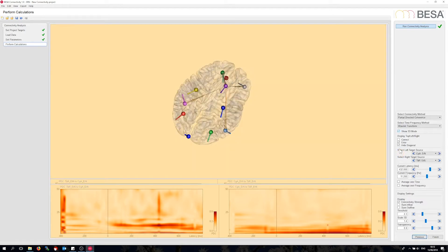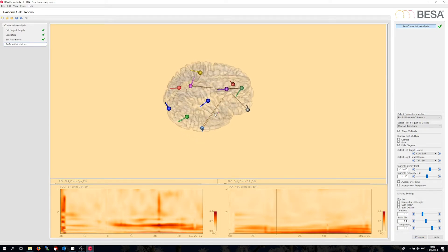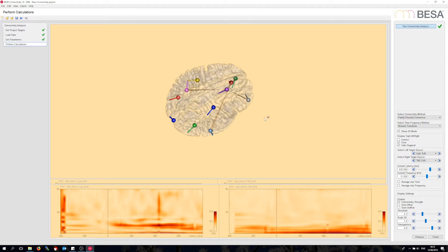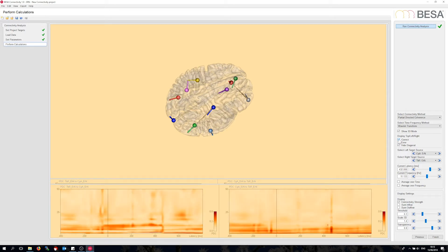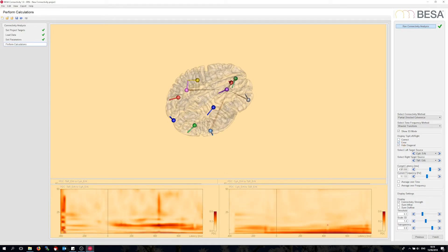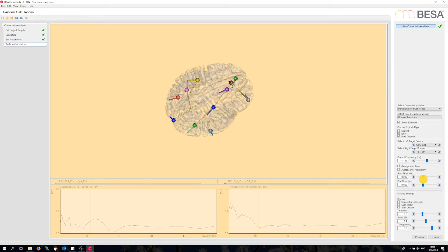Start the 3D mode again, and I see the strong connection. It may make sense to average over the time segment where this processing takes place, especially in this case of late responses. Let me average over time from around 300 milliseconds to 450 milliseconds.